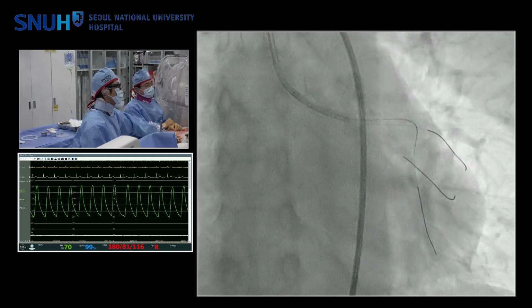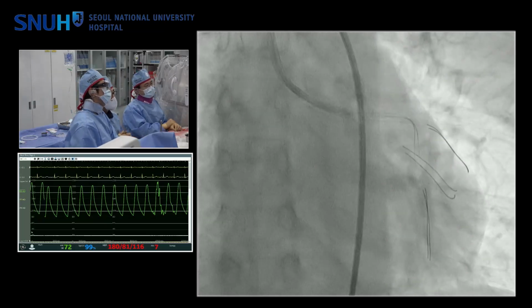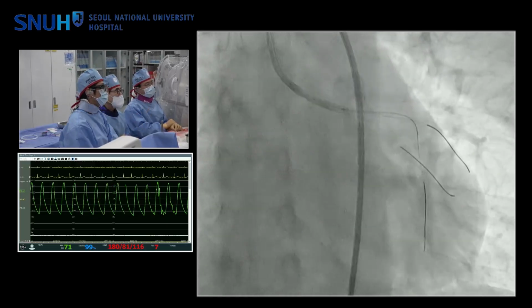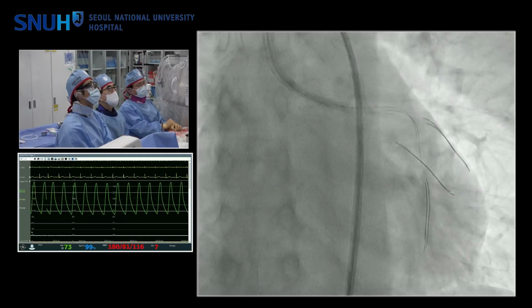Is that on purpose or is that one of your tricks? Dr. Kao, you're very keen. Yeah, that's my favorite arrangement. With this inflation, we can expand more outside of the catheter.